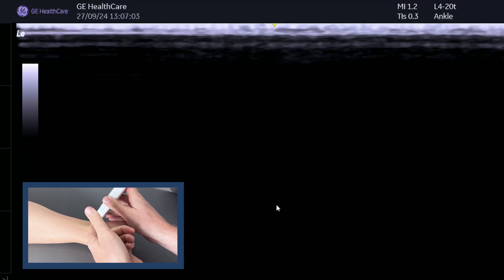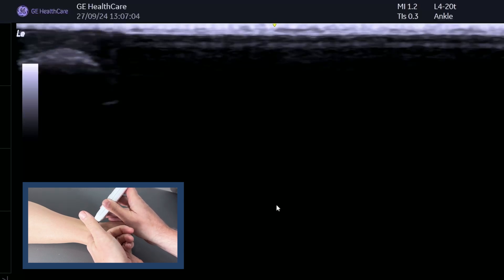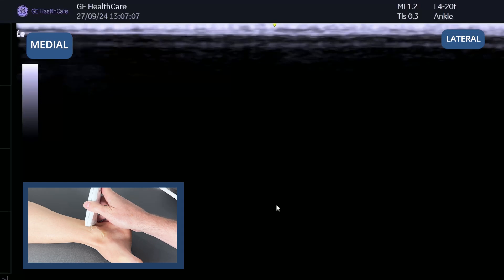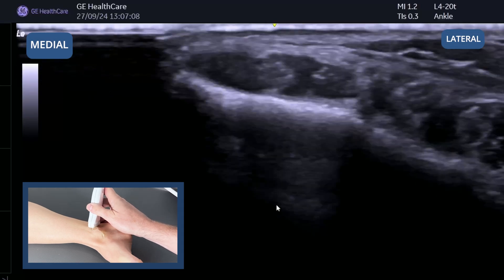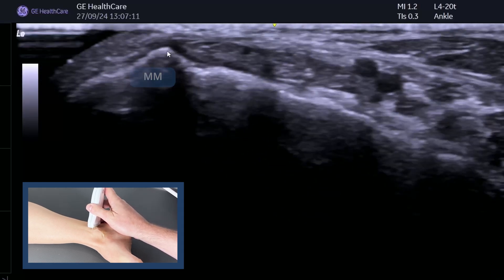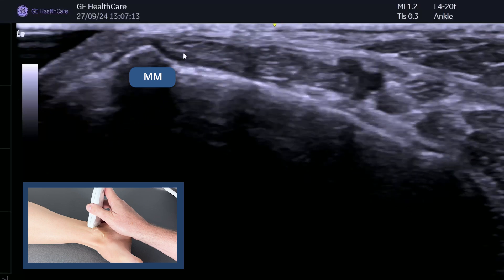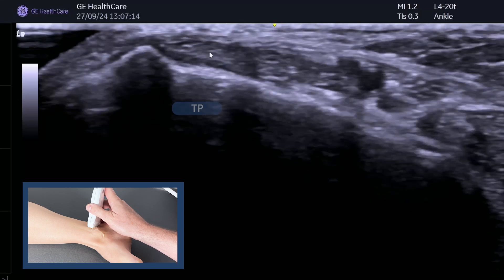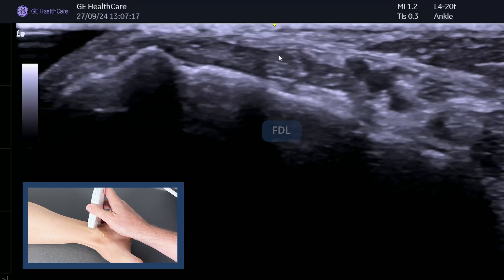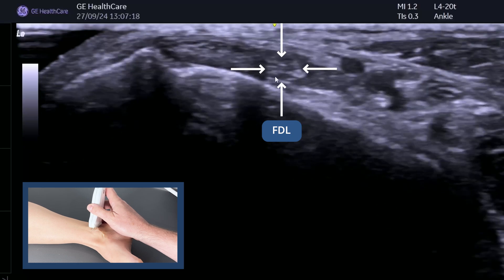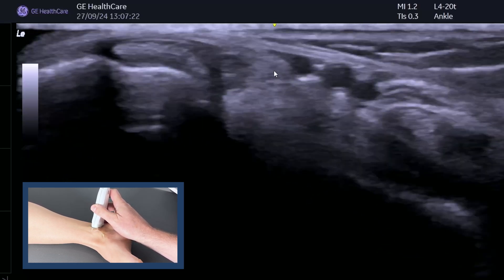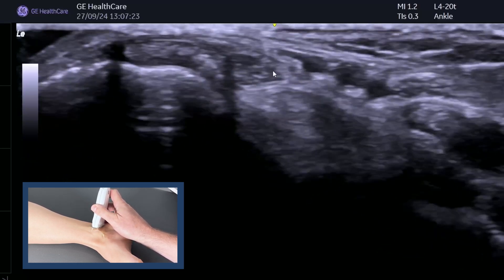The first one is following a tendon. Can you see the left side of the probe is next to the malleolus there? As we come down, the landmark you look for initially is the medial malleolus. Just behind that — posterior — is tibialis posterior, and then you've got FDL. We're actually going to follow the FDL, because remember the knot of Henry is where FDL overlaps with FHL.